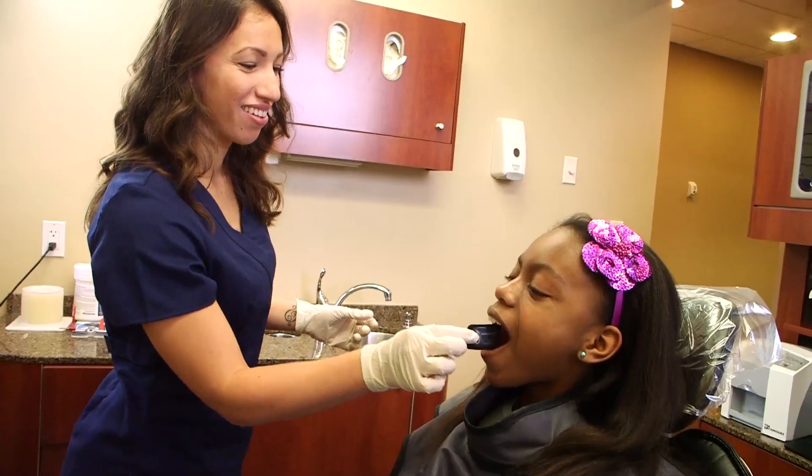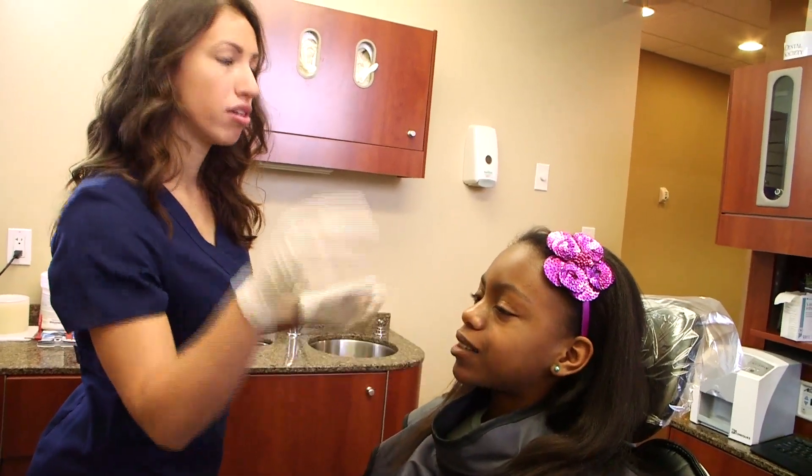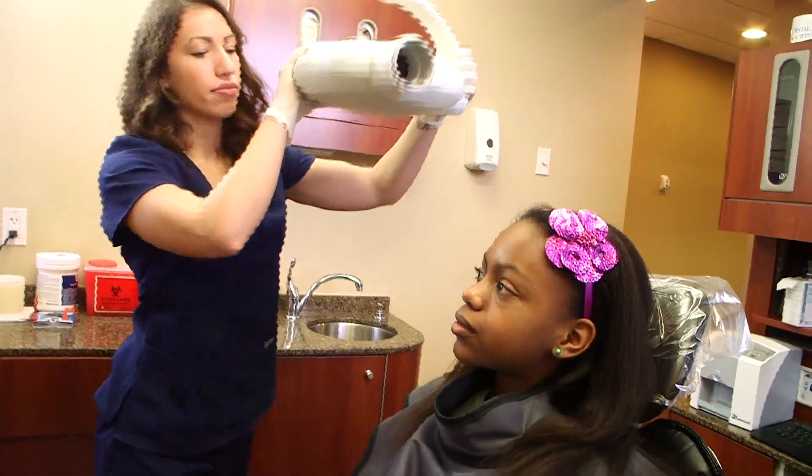ScanX has also reduced the amount of retakes needed. The entire PSP surface area is active, which means we capture 30% more of the anatomy than the comparable-sized wired sensor. The comfort of the PSP also makes it easier for our patients to stay still during their x-rays.